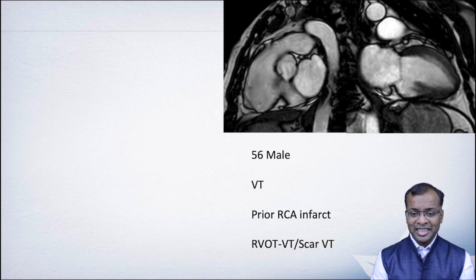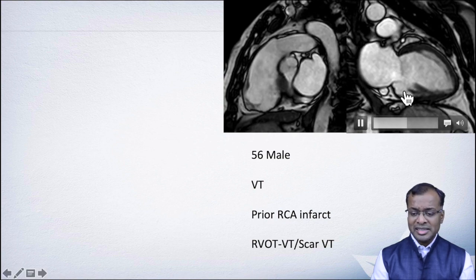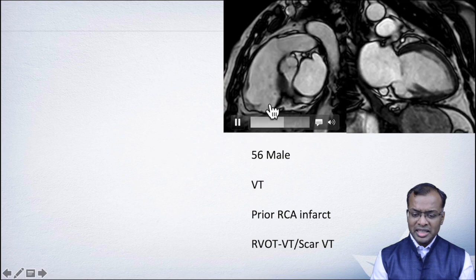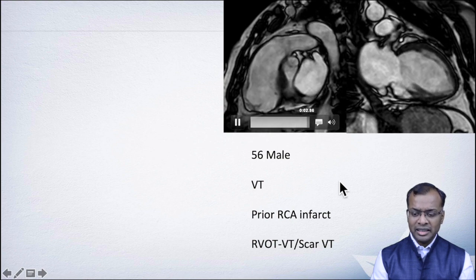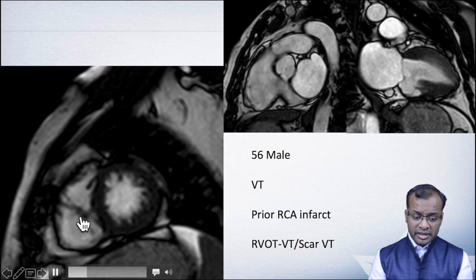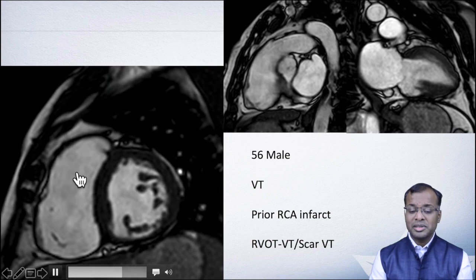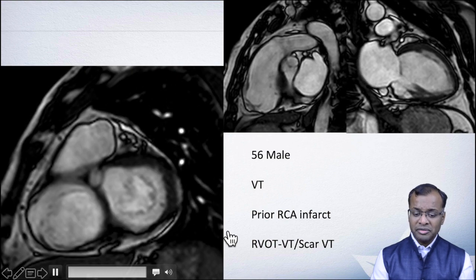And for that, we had done a cardiac MR. You can see here that the basal inferior wall is thinned out and not moving well, in keeping with RCA infarct. Then again, when we start looking at the RV free wall, you see that this is dyskinetic on the RV side. You look at the short axis fully, and this is the RV. You will start to see early areas of microaneurysm formation in the RV free wall, and there is dyskinesis of the RV free wall.